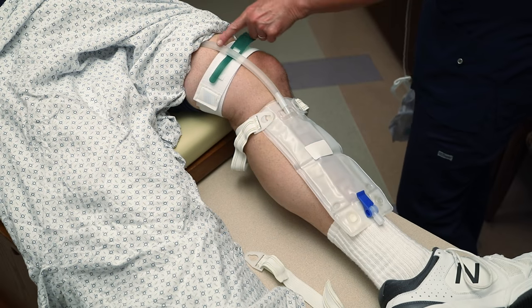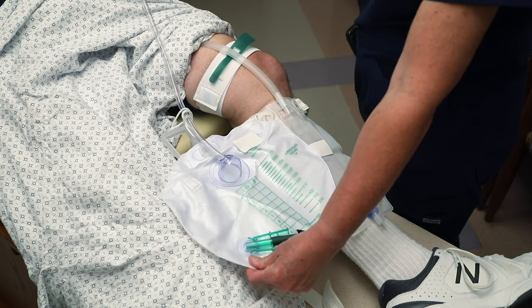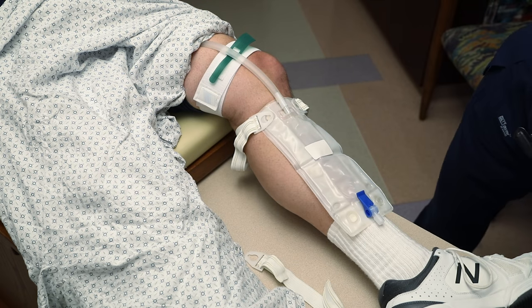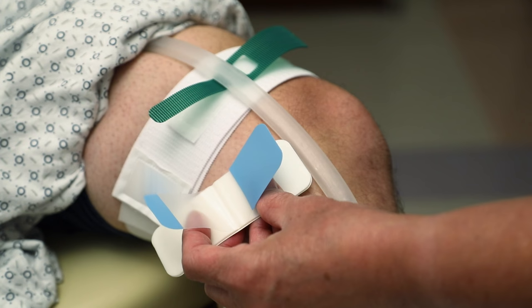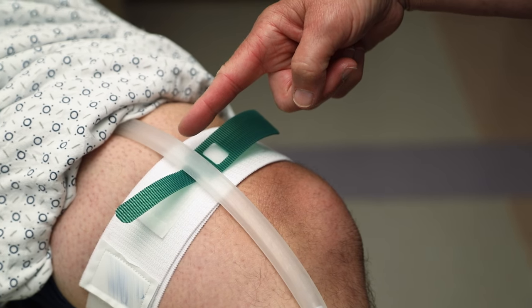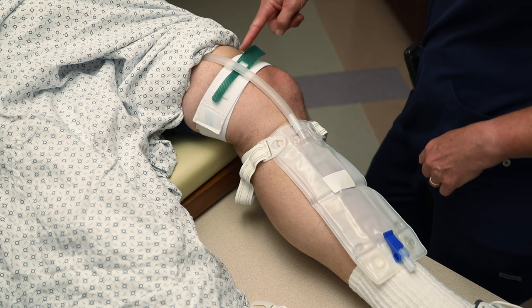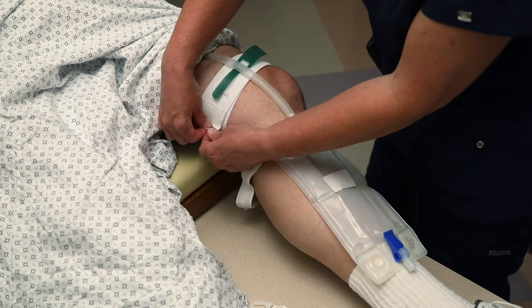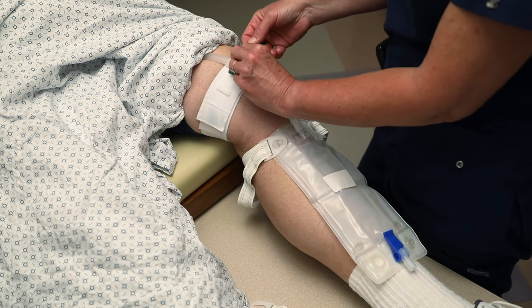A catheter is attached to leg bags and night drainage bags. It is important for the tubing on the leg bag or night bag to be secured to your leg to prevent pulling on the catheter. Tape, an adhesive anchoring device, or a leg strap can be used to secure the tubing on the drainage bags. If a leg strap is used, secure the leg strap comfortably to your leg and open up the green securing loops to secure the tubing in place.